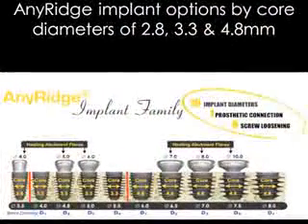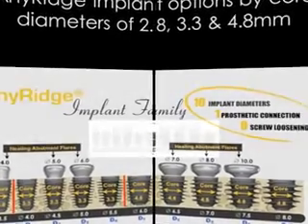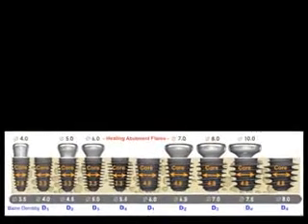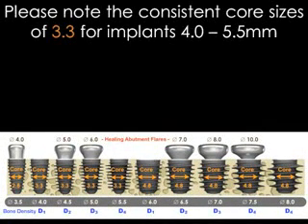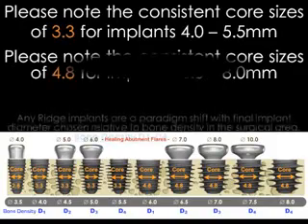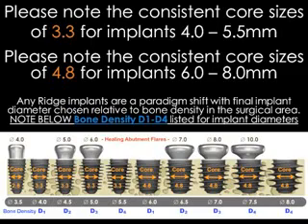The thing to note with all 10 different diameters of implants, as you can see by this picture here, is from 3.5 all the way to 8.0, it utilizes the same prosthetic connection. Which, guess what? What does that mean? That means you're going to have a lot less confusion regarding different prosthetic abutments, what size abutment do you need, what size healing abutment in dealing with your different prosthetics. Now, as you can see again, your different healing abutments come in 4, 5, 6, 7, 8, and 10, all relative to that. Now you can see the different densities of bone.